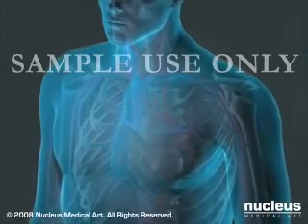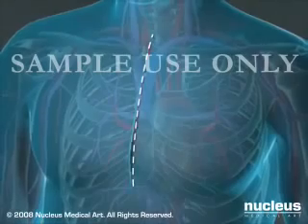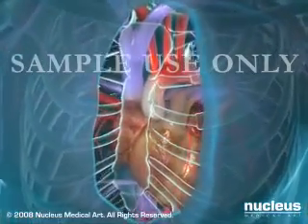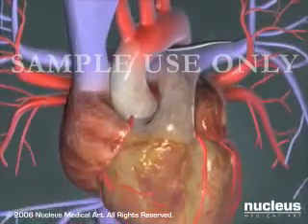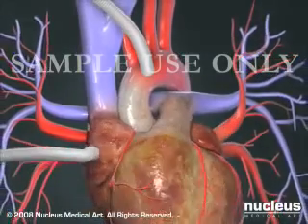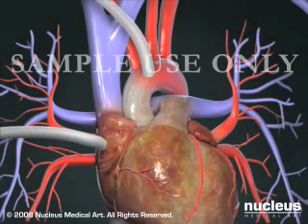During a conventional bypass surgery, your surgeon begins by making an incision in the skin over your breastbone or sternum. He or she will then cut the sternum and move your rib cage in order to get to your heart. Throughout the procedure, your circulatory system will be connected to a cardiopulmonary bypass pump or heart-lung machine. This machine temporarily performs the functions of your heart and lungs during the surgery, allowing your heart to be stopped while the surgeon sews the grafts into place.